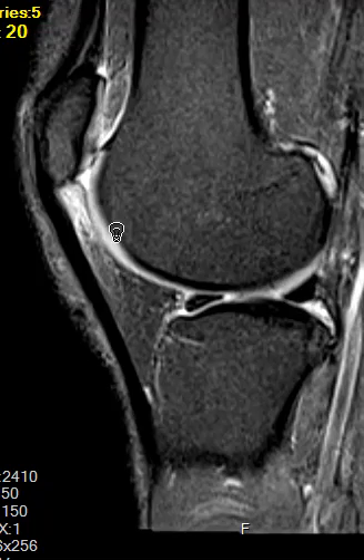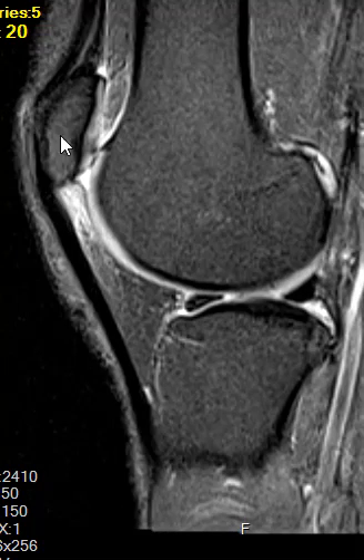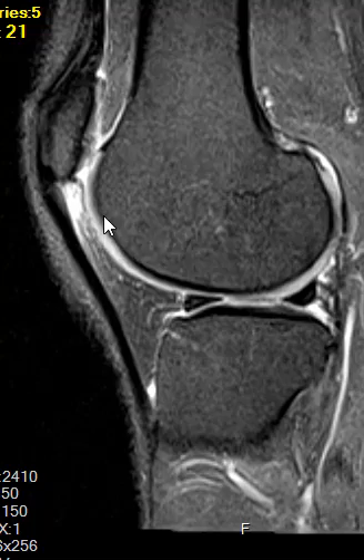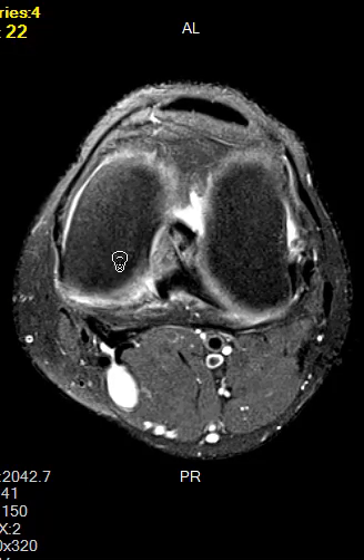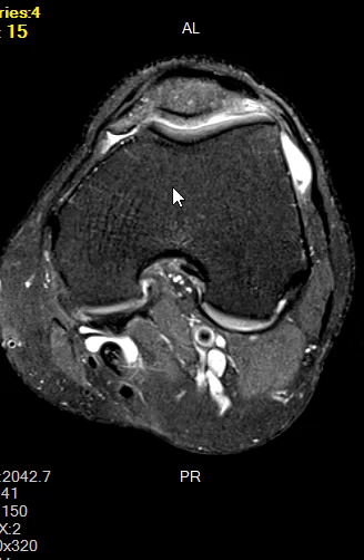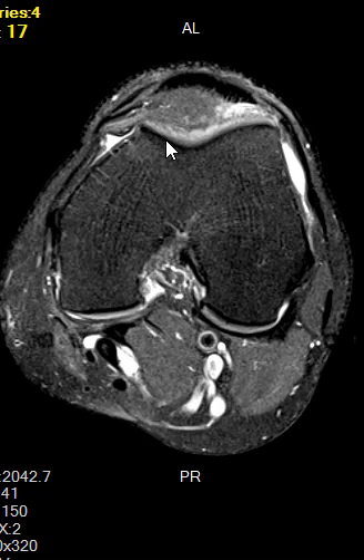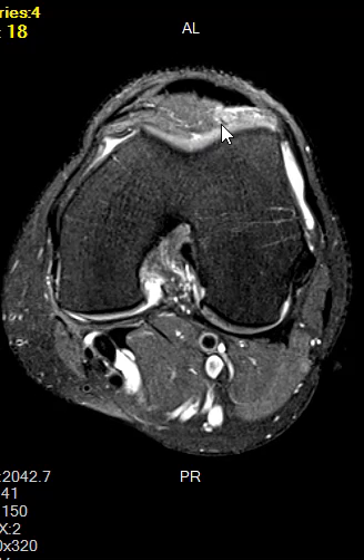The fat pad is getting pinched or impinged upon between the patellar tendon, the patella, and the lateral part of the femur. We can also see this on another view here — this is a view where the kneecap is up front and the femur is behind. This little trough here is the trochlea — this is a relatively shallow trochlear sulcus.